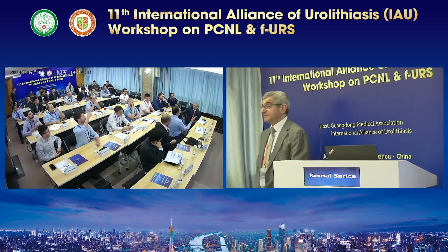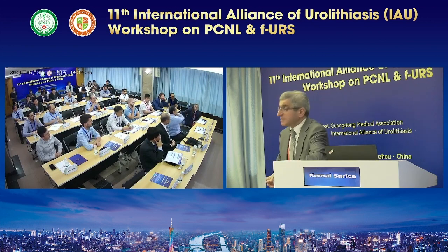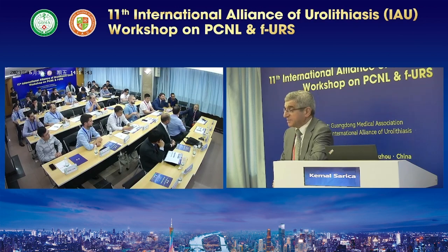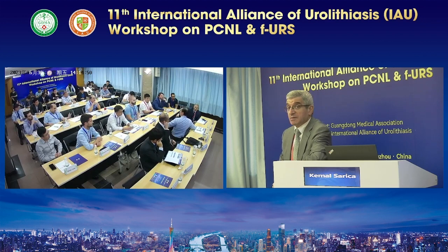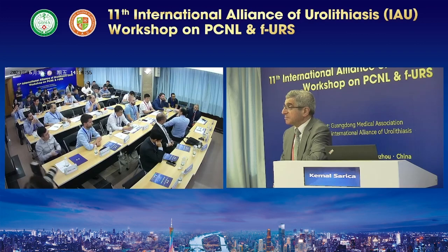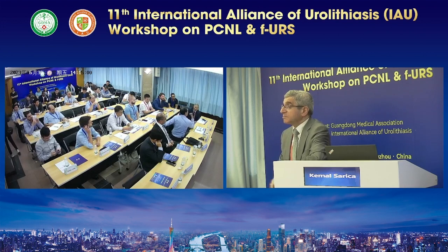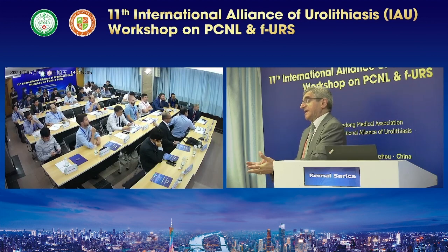I think the cost of disposable scopes has gradually come down a lot. So it's now nearly one third of what the initial scopes were. So it's becoming more affordable in centers where there's a high cost of cleaning, high cost of breakages, like ours, where the cleaning center breaks our scopes a lot. Then it makes mathematical sense to use more disposable scopes, isn't it? Exactly.